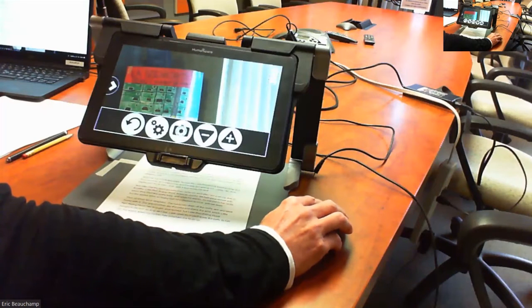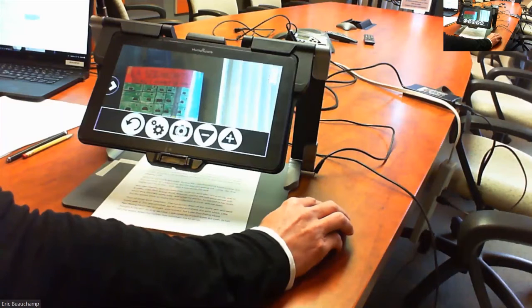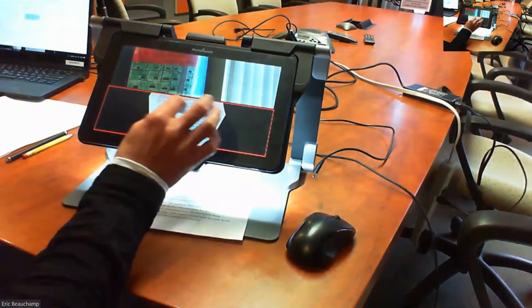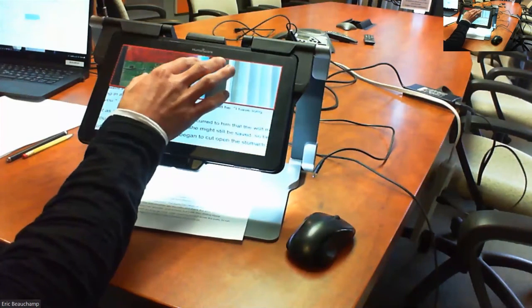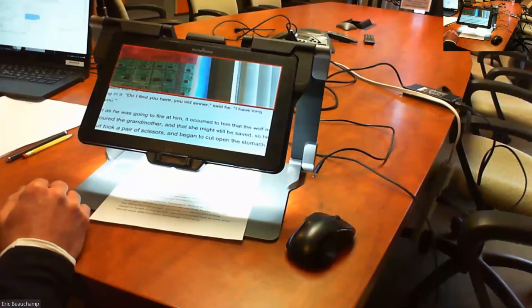So I was looking at the video from the student learning math. If the student needs to copy what the teacher is writing, but has to swipe between live and magnifier, he or she may miss an important step accidentally. Well, you can swipe, or like I said, you can have the split screen. Sometimes the split screen is a bit small, but you can really zoom in if you want on the near view and on the distance, like that, and zoom in. So you can have both at the same time with no problem, or you can use the swipe back and forth.